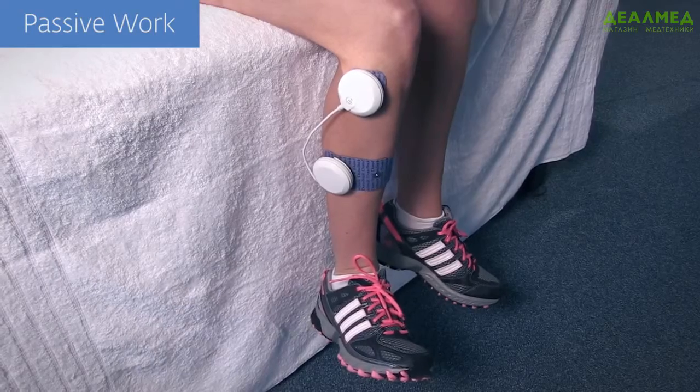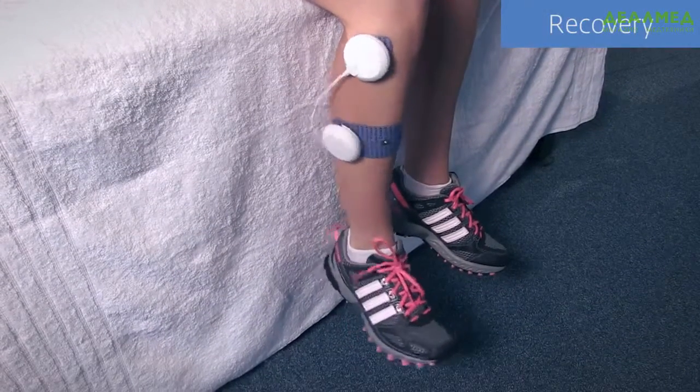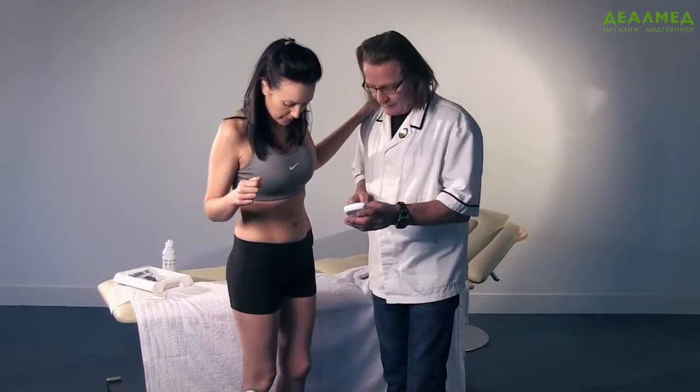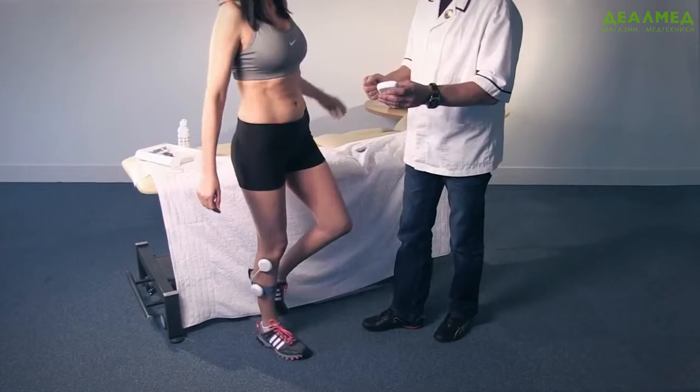Muscle work can be started in non-weight bearing, and if desired, eccentric work on the peroneals, the everters, can be induced by actively recruiting the foot's inverters.